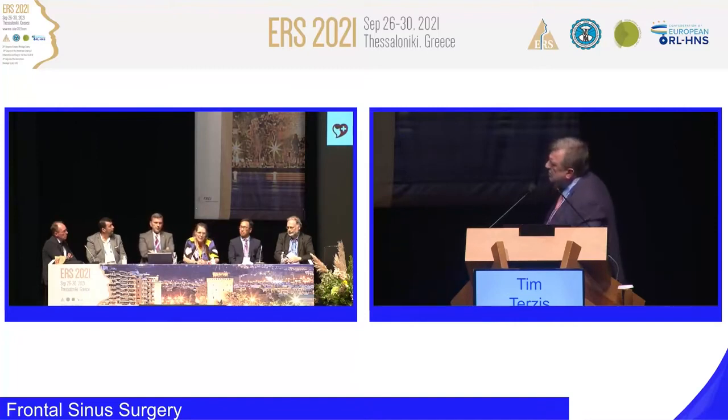But why does he only have pain on the right side? Because most of the pathology is on the left side. And also I would like to know how long this CT was after his last diving. The CT was done about 2 weeks after the episode. 2 weeks after a barotrauma, you expect more disease than this. So then I would ask him, did you have a cold with the same sort of symptoms? To get a little bit more feeling whether the pain actually came from that frontal sinus.